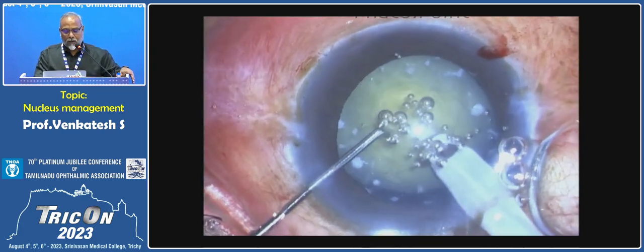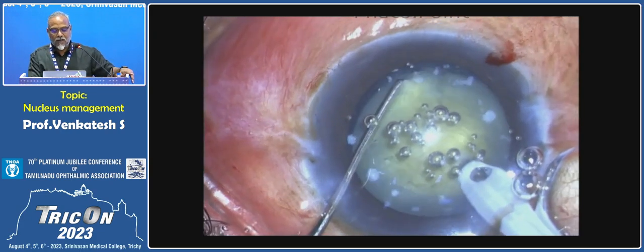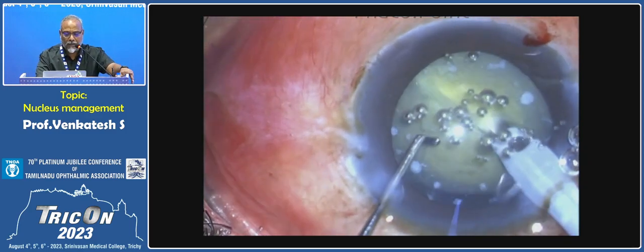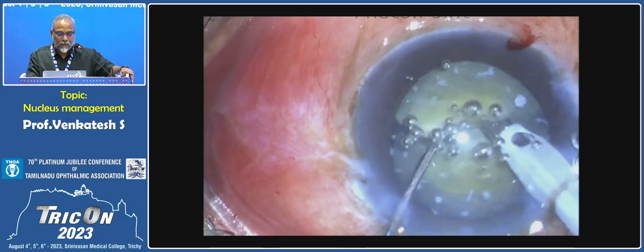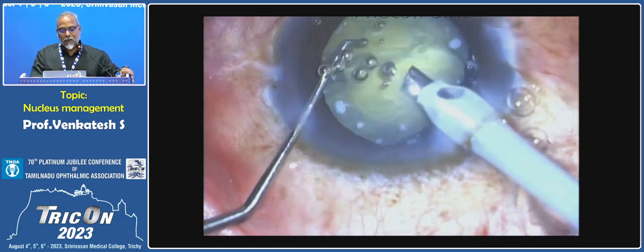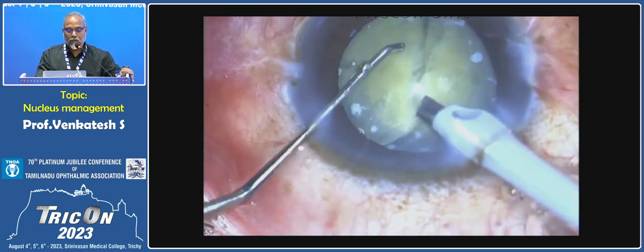If you try to do a direct chop and the chop slips, then the sharp chopper will go right through and hit the posterior capsule. There is no epinucleus cushion or epinucleus cover to protect it. So now I'm impaling and holding on to the endonucleus, and what I have is a blunt chopper.